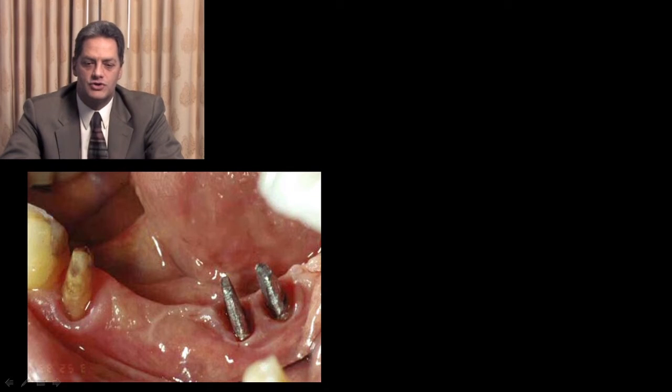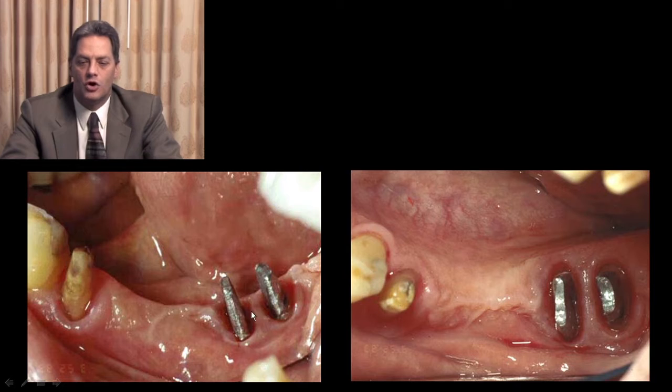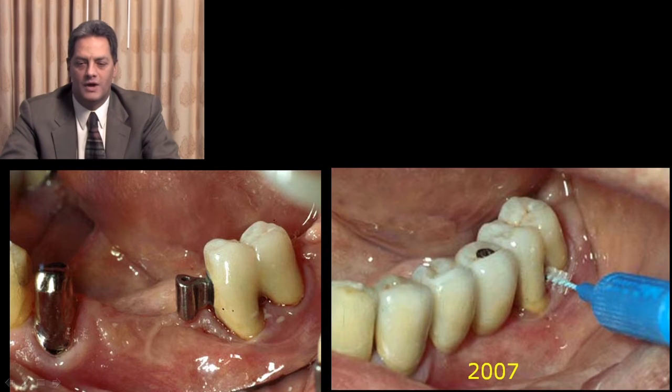In this situation, the patient had the lower left molar hemisected as he did not want to have any implant dentistry. The problem is that the path of insertion on the molar is not the same as the one on the premolar. So what we did was a little bit of orthodontics to separate the roots so the patient will be able to maintain a healthy environment. And the final crown happens to be cemented permanently. It was tapped, and we have a T-block that is parallel to the telescopic crown on the premolar. This way we have a restoration where it's permanently cemented and the front segment happens to be screw retained. Telescopic crown is permanently cemented.